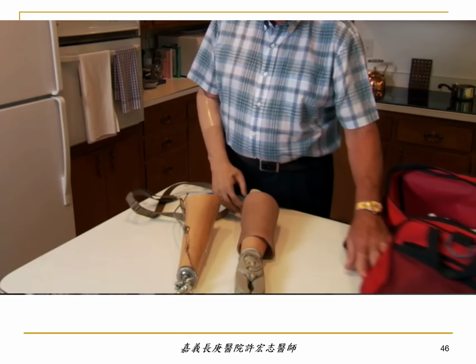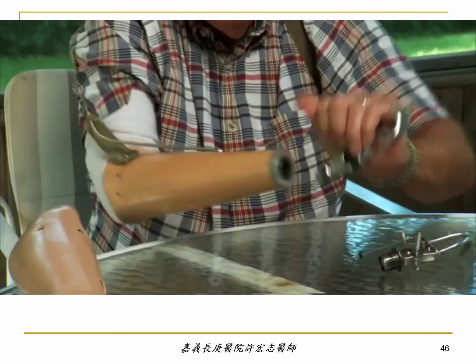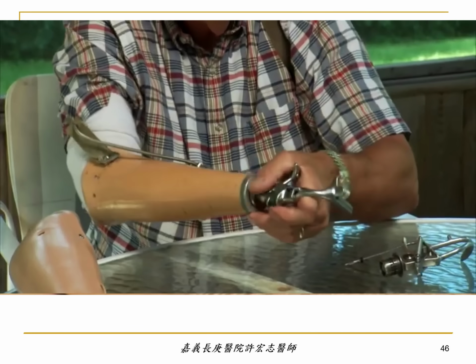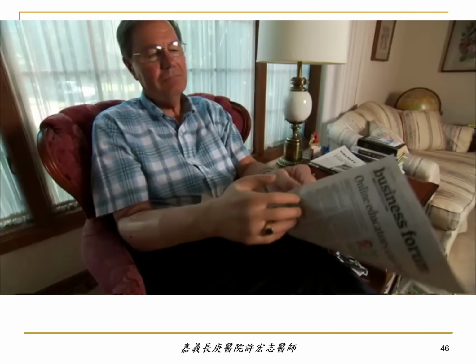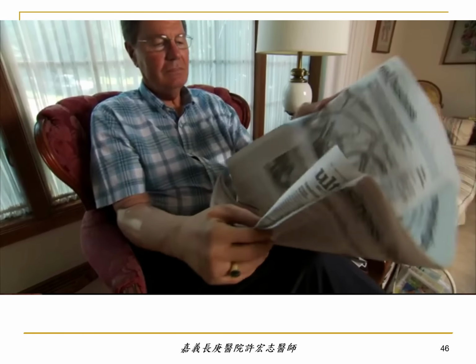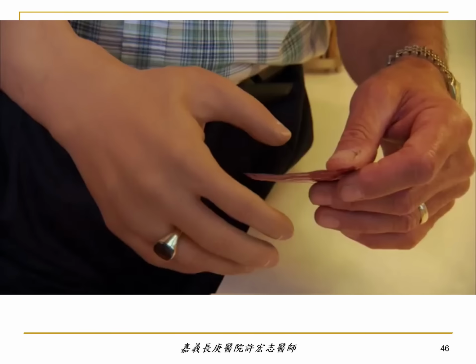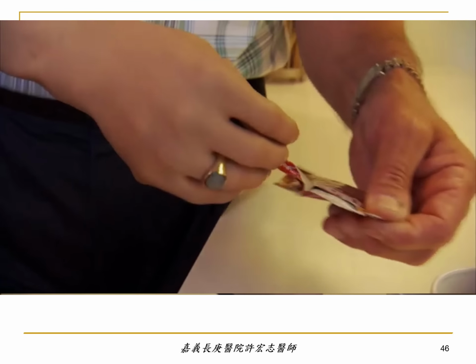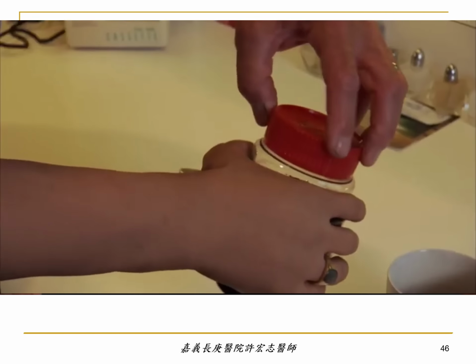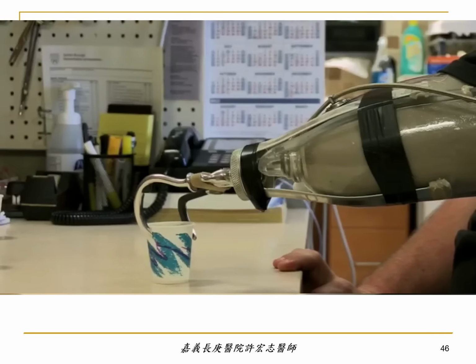I'm on my 3rd major prosthesis. It's not uncommon for me to perhaps change in the middle of the day. I mean, it only takes just a couple of minutes and then I'm ready to go to my next task. I learned that the company that manufactures all this prosthetic stuff was coming out with a new hand. It has a movable, powered thumb, so it can provide you with multiple different grips for gripping things. Plus, it looks extremely cosmetic.